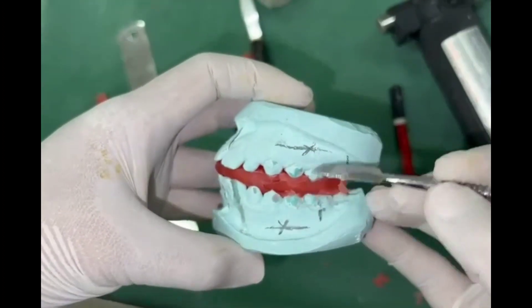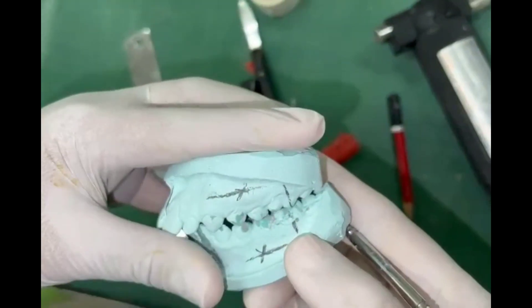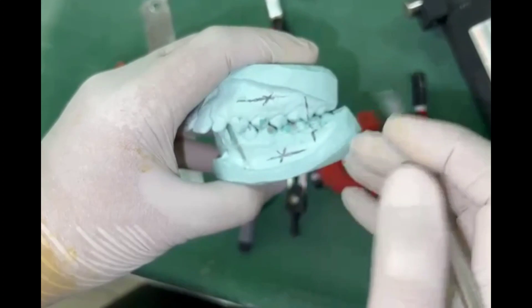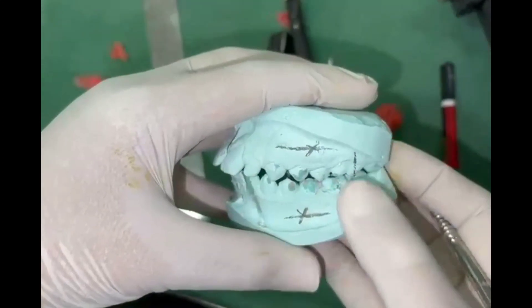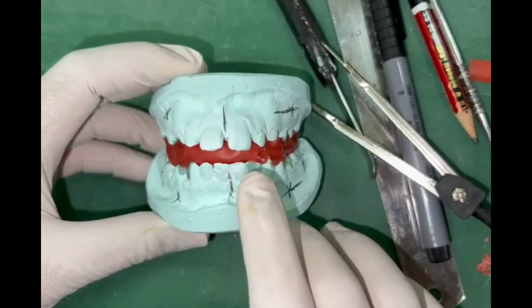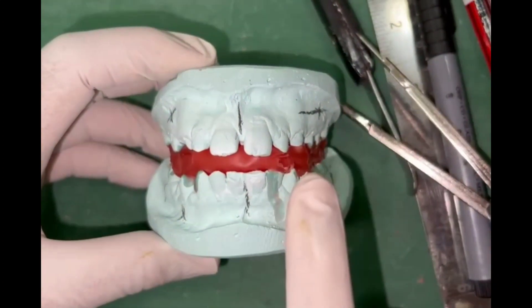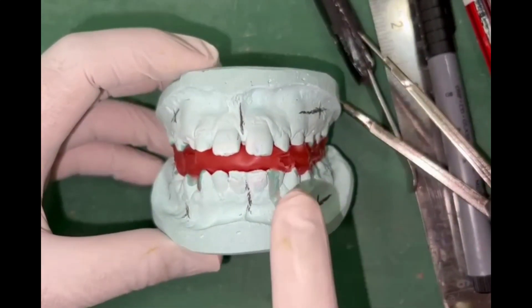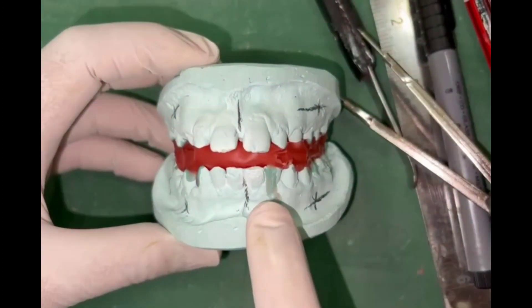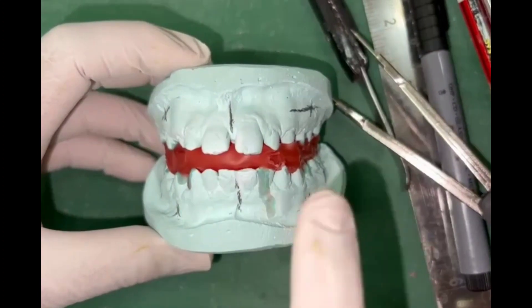Vertical measurements should be taken with the bite and without the bite so that you know how much bite opening you have done. The sagittal advancement can be measured after placing the bite. If the midlines are not matching in the patient's mouth — that is, if there is a dental shift when registering the bite — do not try to match the midlines, otherwise you will create a facial asymmetry. In this patient the midlines were coinciding, so we have kept them coinciding. If there is a dental shift, you should not try to match the midlines.